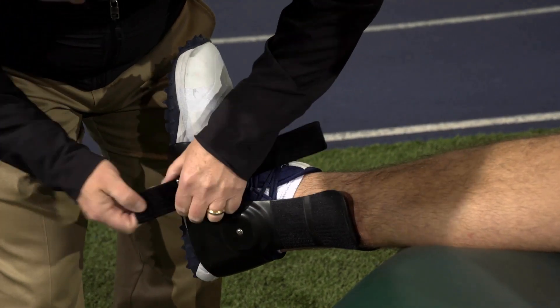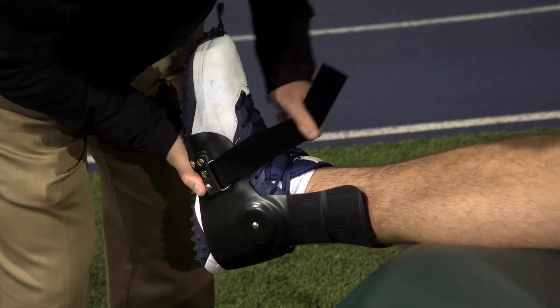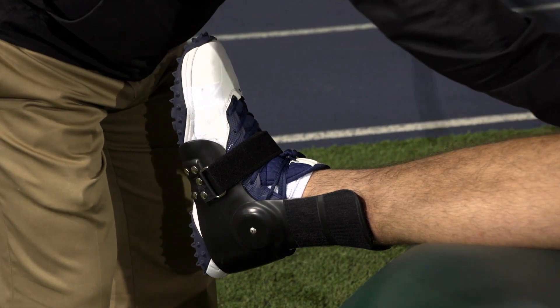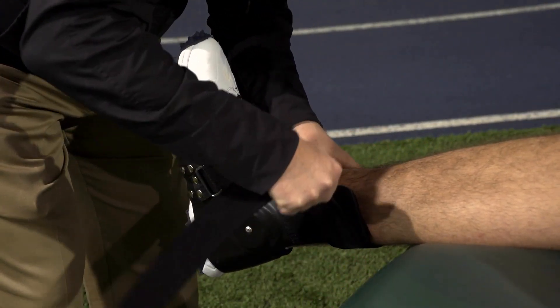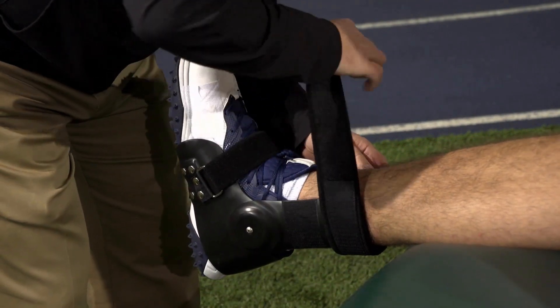Step 2: Secure the mid-foot strap with medium tension. Step 3: Position the uprights running parallel to the tibia and fibula as close as possible.